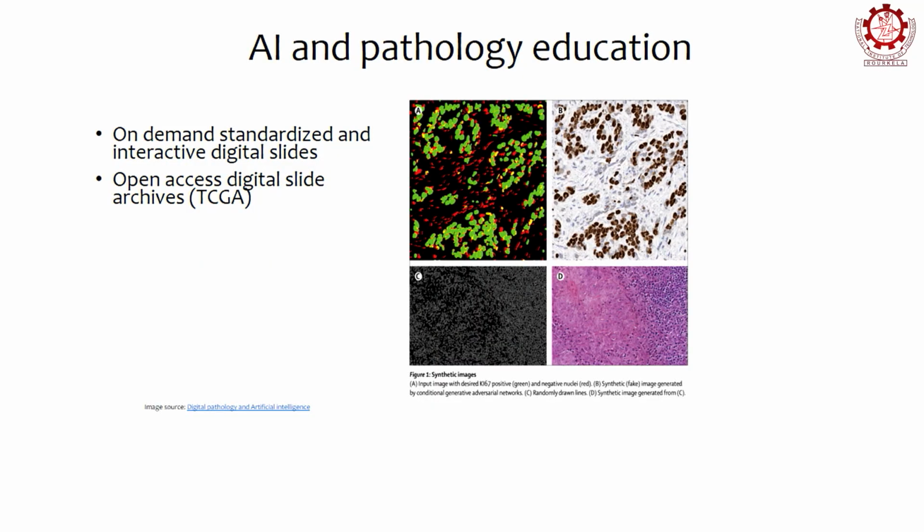So if any of you is interested in looking at or playing around with digital pathology slides, you can access the TCGA website. So TCGA is an initiative in the US where they are collecting a lot of images and corresponding genomic data, and for a lot of these data sets that are out there, there are also corresponding radiological data on TCIA, the Cancer Imaging Archive.